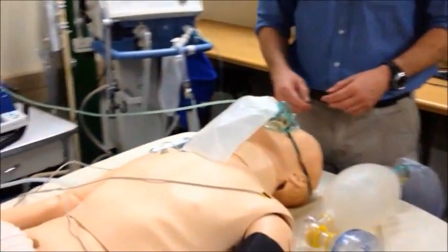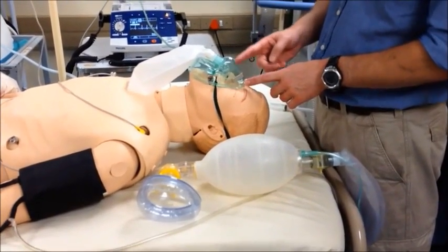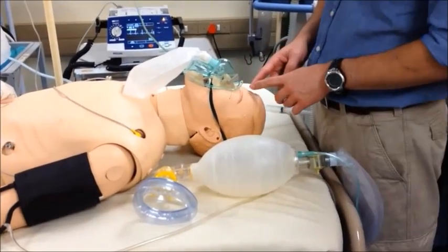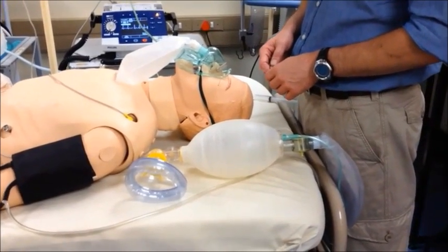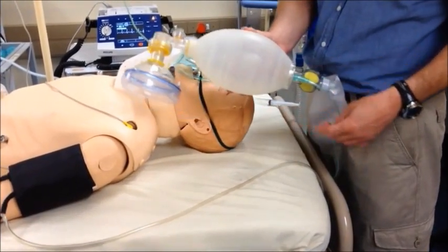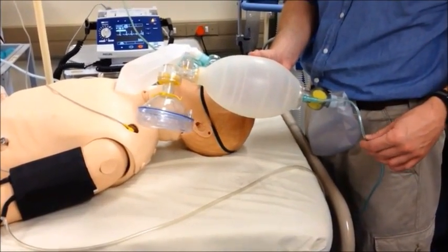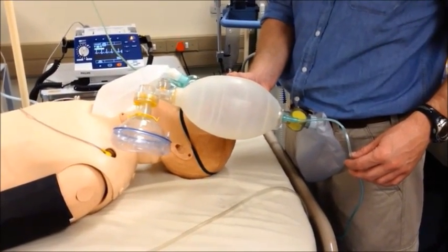The first thing, after your equipment has been checked and your bedside equipment is checked and connected to the patient, would be to pre-oxygenate the patient. To pre-oxygenate a spontaneously breathing patient, simply connect them to a high flow oxygen mask such as this non-rebreathing mask and wall oxygen, and make sure that they are breathing high concentration oxygen for three to five minutes. In a patient with inadequate ventilation, assist their ventilation with a ventilation device such as the self-inflating bag valve mask device for approximately eight vital capacity breaths.